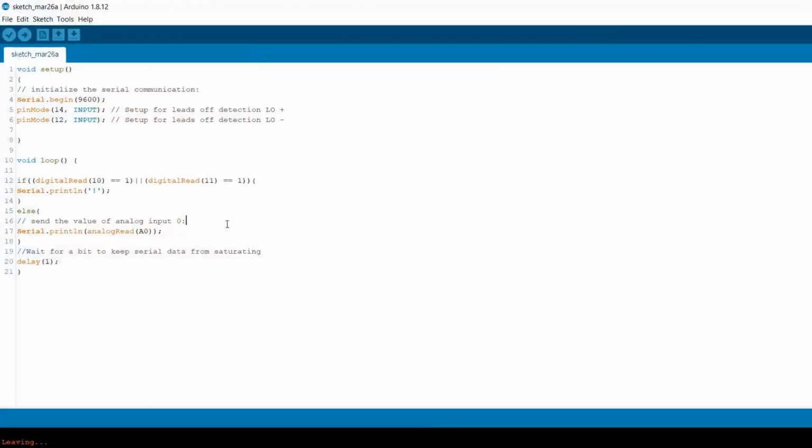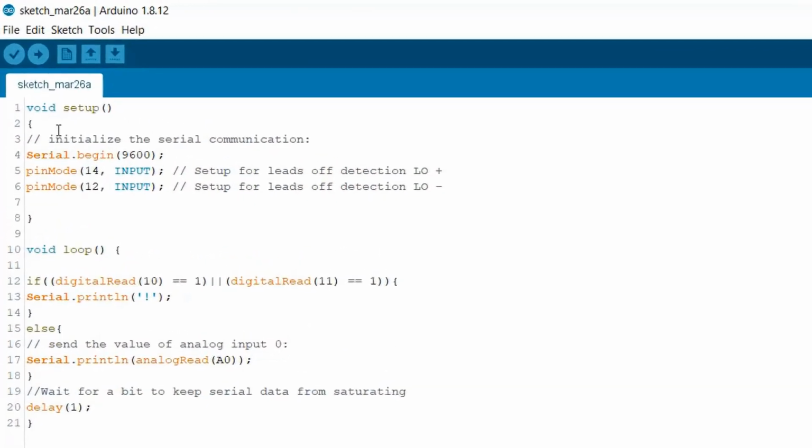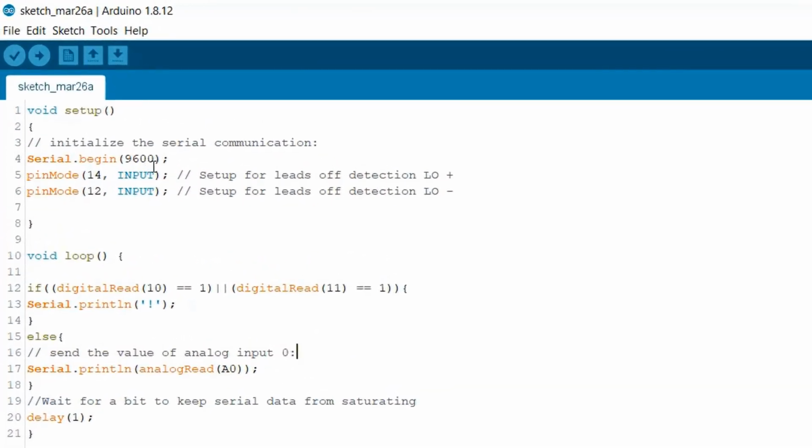So now let's begin with the simple program first. Under the void setup function, we have initialized the serial begin as 9600. So we are detecting LO plus and LO minus as GPIO 14 and GPIO 12. We are just comparing the digital output from the 2 electrodes, that is LO plus and LO minus. Under the else condition, we are just reading the analog value that is generated from the A0 pin.